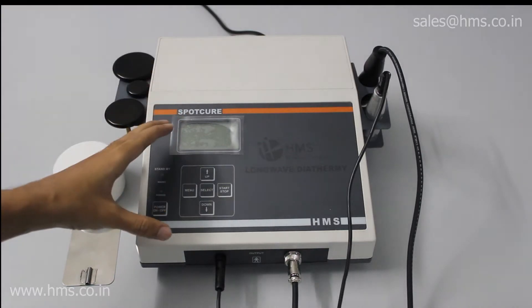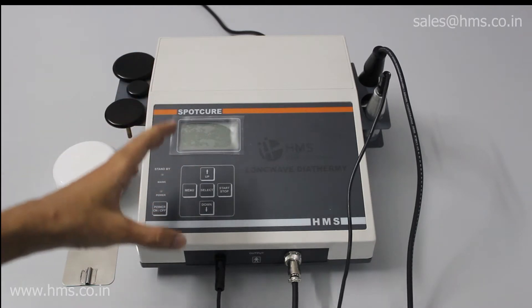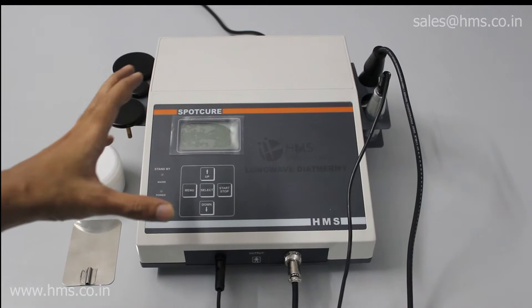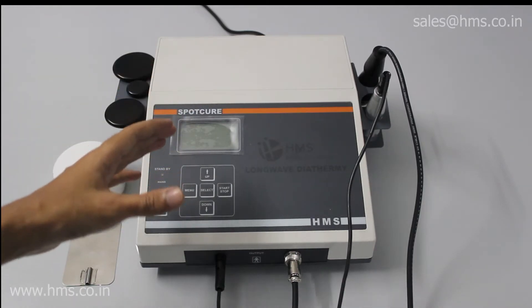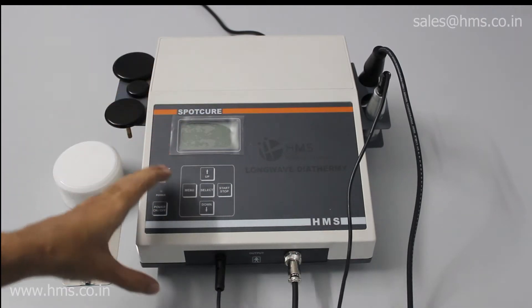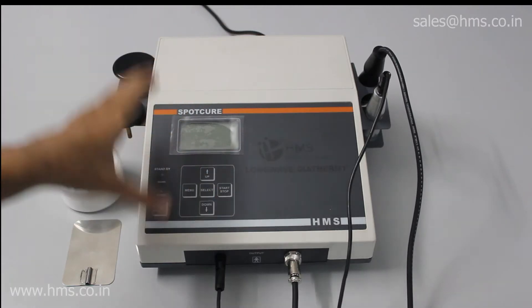This is HMS Medical Systems long wave diathermy and we call it the Spot Cure. This is the equipment itself and these are its overall dimensions. It's very small and lightweight, which makes it very easy for home surgeons to carry the equipment anywhere they go. That's a great add-on feature with this Spot Cure.